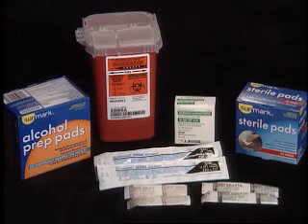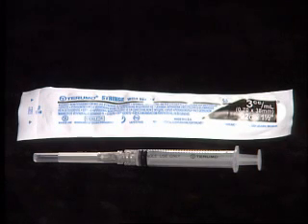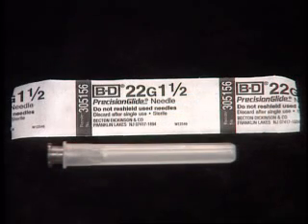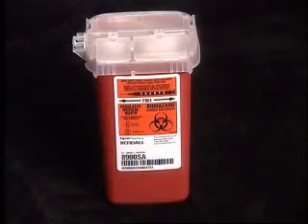The supplies you will need are the vials of HCG, or Human Chorionic Gonadotropin, the 3 cc syringe with 1½ inch needle attached, a half inch needle for subcutaneous injection or 1½ inch needle for intramuscular injection, alcohol wipes, sterile gauze pads, and a sharps container.